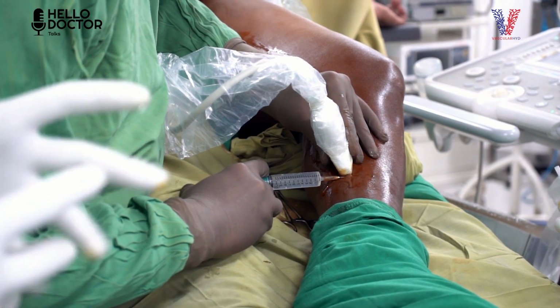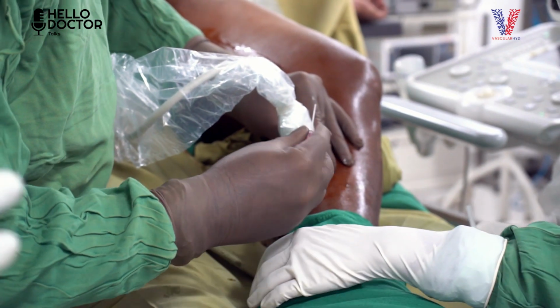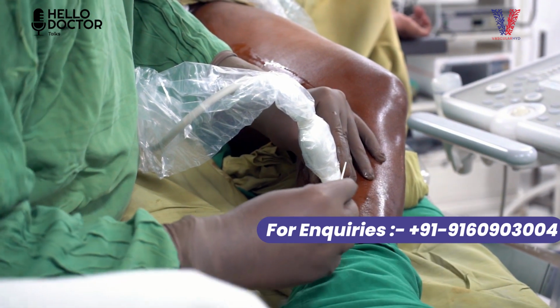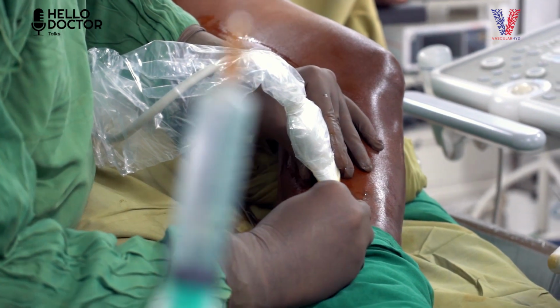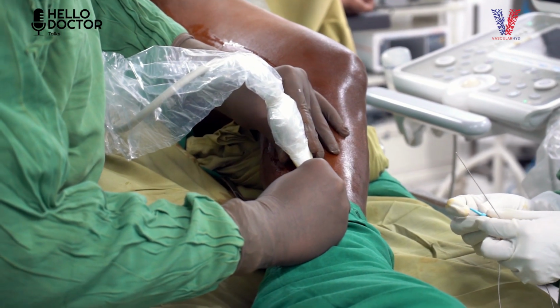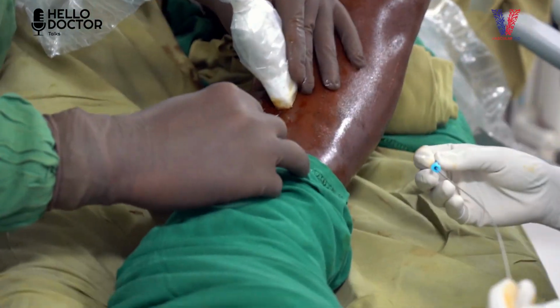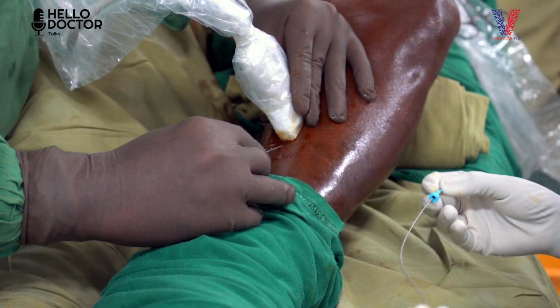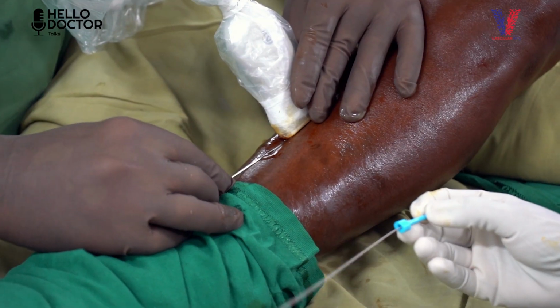So this procedure is completely under local anesthesia. The patient is fully awake, and when we are giving a local anesthesia at the point of access, we inform the patient that we are giving a small injection. This is a very fine needle that we have used to give anesthesia, a 26 gauge short needle. And that is an 18 gauge puncture needle or the access needle, which we are going to use to take an access into the great saphenous vein.